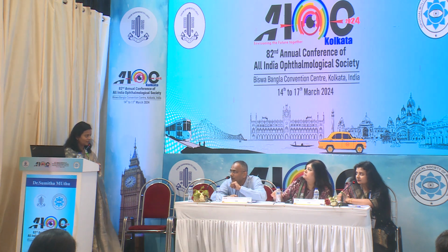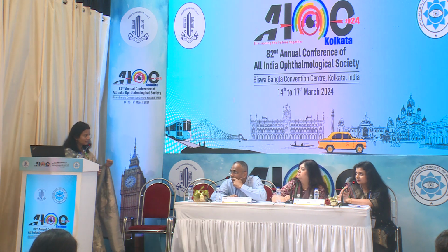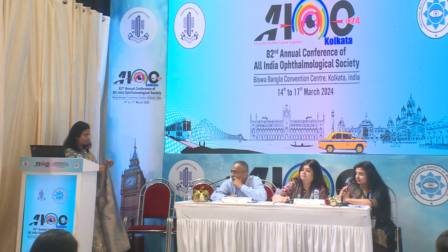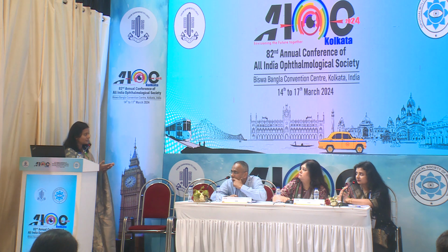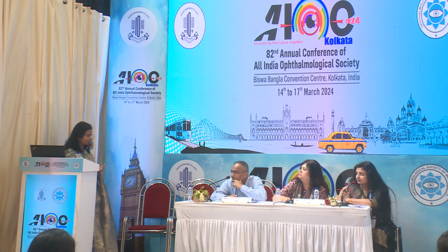And who holds the endo illuminator? The doctor or the assistant? The assistant. Sometimes when you are not performing the surgical step, the surgeon himself holds it, like when you just want to visualize, confirm if the vitrectomy is complete or confirm the margins of the rhexis. If not, the assistant holds it. Suppose it is required to complete the anterior vitrectomy as the surgery is being done, then the assistant holds the endo light. Of course, it requires a little learning curve as well.